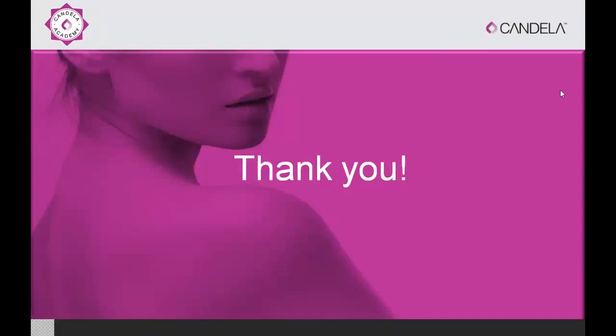Combination with the fractional CO2 is interesting. I did not speak a lot about it, but I use that for some of the very resistant tattoos, where I pre-treat with low density fractional CO2 followed by the PicoWay. But these are for the resistant tattoos, and you need to have the experience in that. And also for some cases of nevus of Ota and of chronosis, combination treatment with the fractional CO2 is helpful too. So again, that is something that more and more of us are doing in terms of combination treatment.